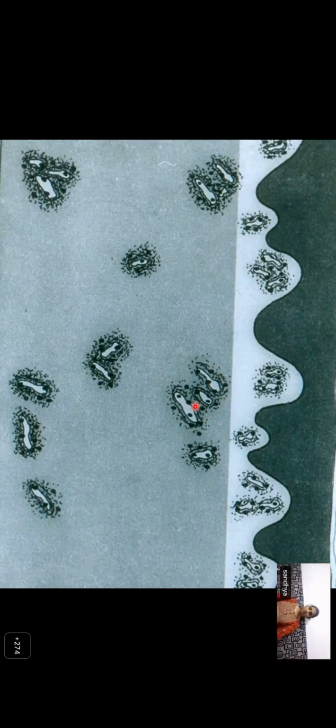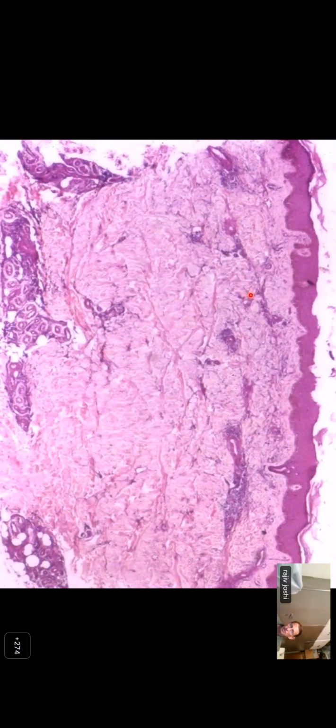Then you have vasculocentric infiltrates with damage to the blood vessels, vasculitis. If you see here in the dermis, most of the blood vessels seem to be involved, and they are made prominent because they have pink fibrin deposits in their walls. And you also have an interstitially scattered infiltrate, which has neutrophils and neutrophilic nuclear dust. What you see here is leukocytoclasia, the breaking up of the neutrophilic nuclei. So this is very typical of leukocytoclastic vasculitis.